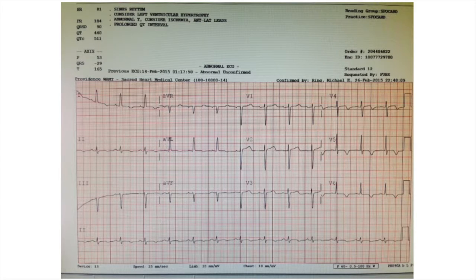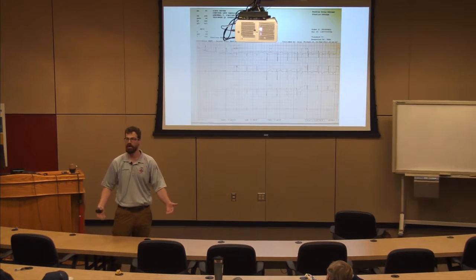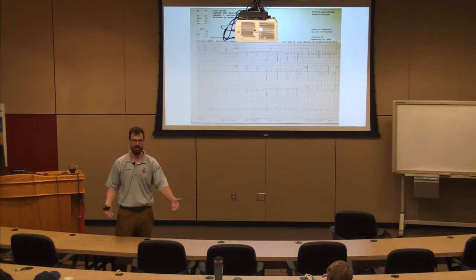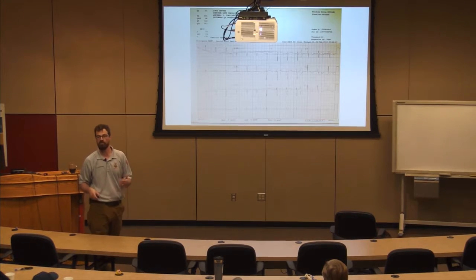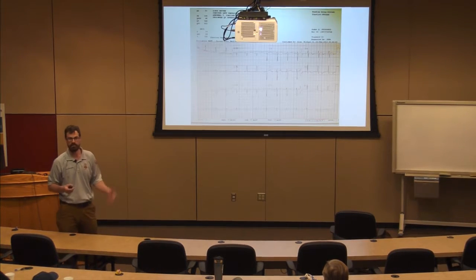I don't know what the medication was. There's a whole plethora, a pharmacy of meds in the house, right? She took a bunch of them. How do I know whether or not there's some sort of cardiac monitoring that needs to take place on this person? Well, I'm going to look at intervals on my 12-lead EKG. So I get a 12-lead, and I look at the QRS. Do I have a wide bizarre QRS? No. Do I have a long QT? Yes, I do have a long QT. This person is high risk for torsades and should be monitored.